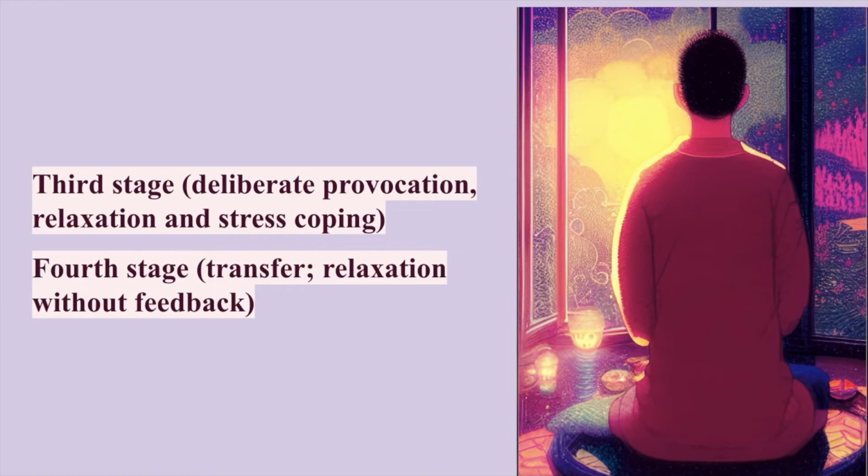So skin conductance biofeedback is particularly suitable for the use of targeted provocation methods because it shows a timely and sensitive response to stimulus, and because this response is also proportional to the strength and significance of the stimulus. Start the measurement and watch your readings for a while. We're not going to be asking the participants to watch the reading, we're just going to be taking it and asking them to relax for a few minutes.